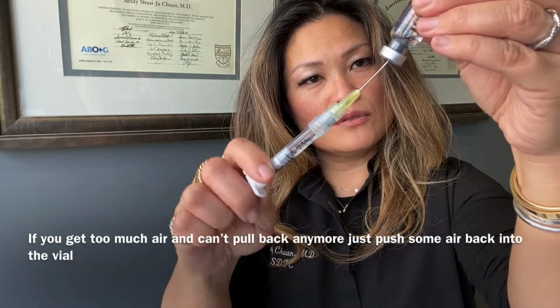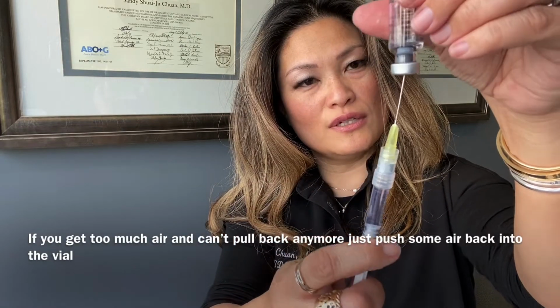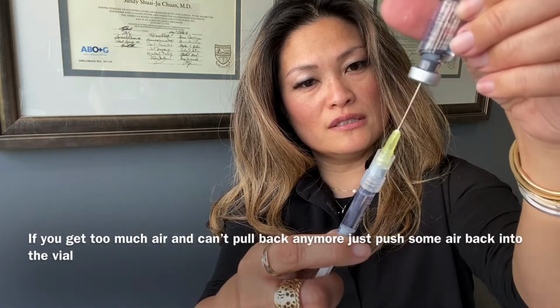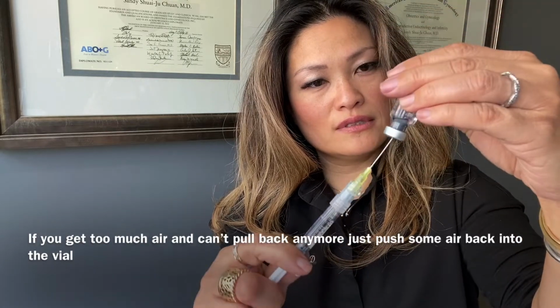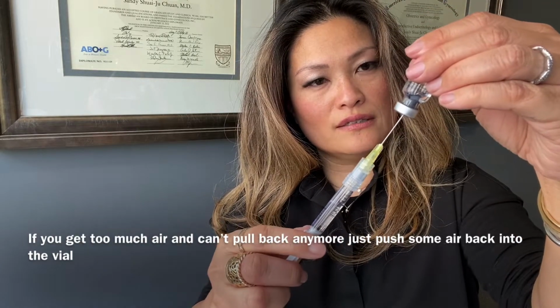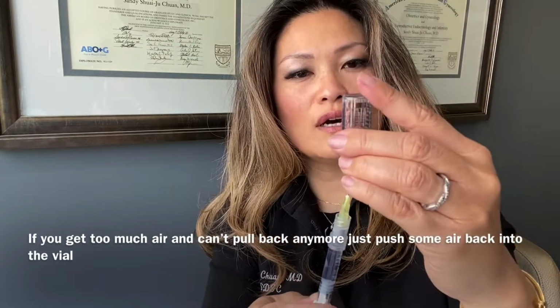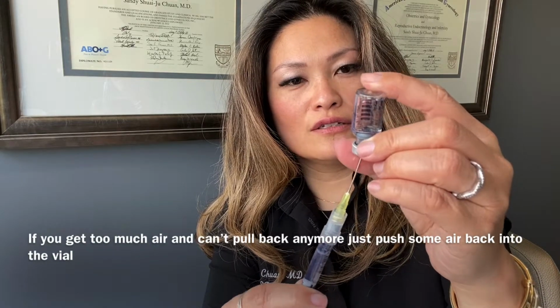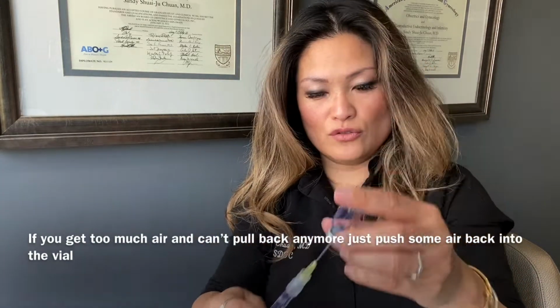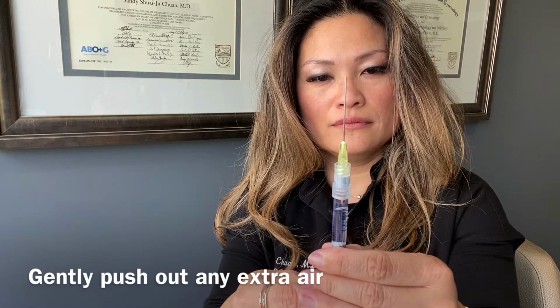So even someone who's been doing this a long time like me can get into trouble. So you want to just tilt your bottle all the way in and get every single drop that you can, okay? And again, if you get a little bit of air, it's okay. I think I was tilting the bottle a little bit too much before. All right, so that's everything. I got every single drop. Okay, so got some air in there. I'm going to get rid of it.